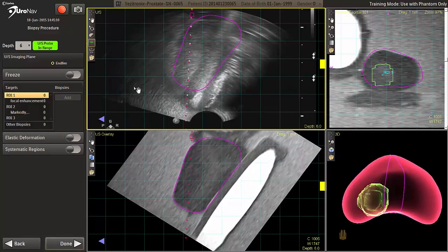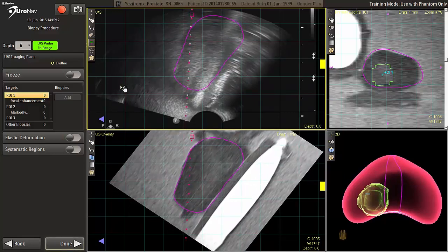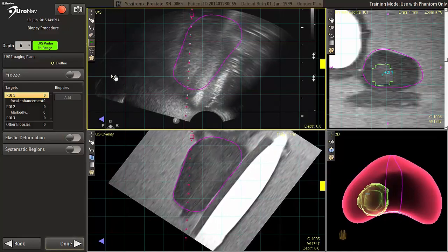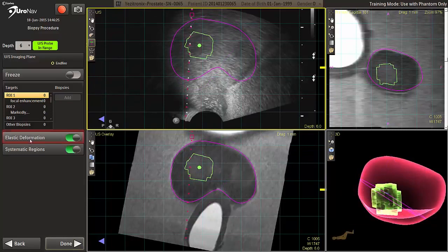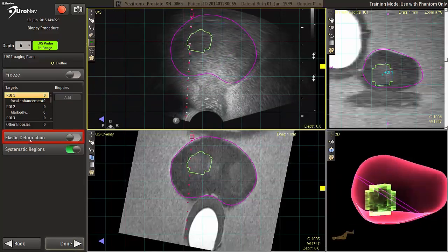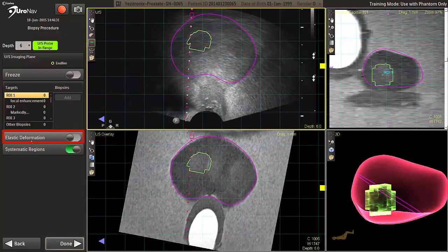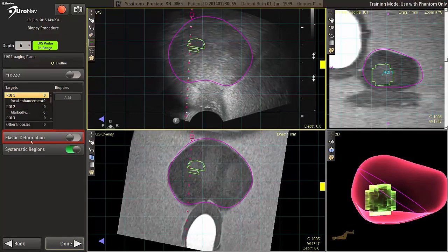Registration must be continually monitored and maintained throughout the procedure. Checking in two planes again may be necessary. The toggle on and off button for the use of elastic deformation is only active if elastic was computed on the previous alignment screen.